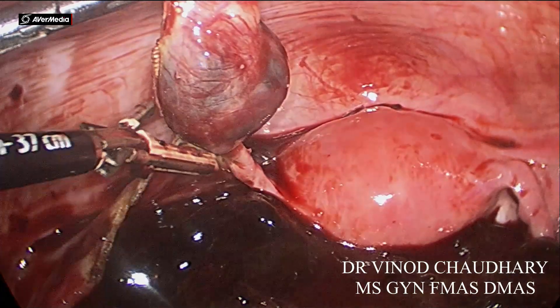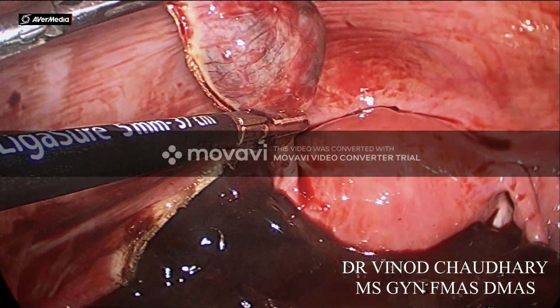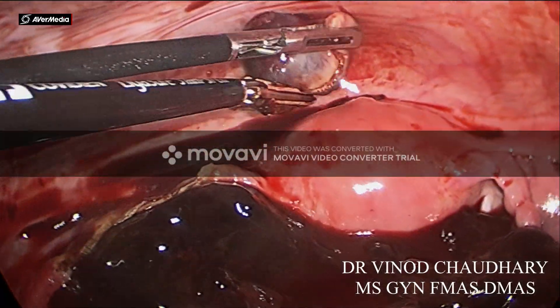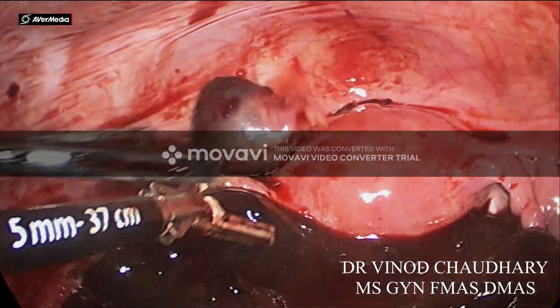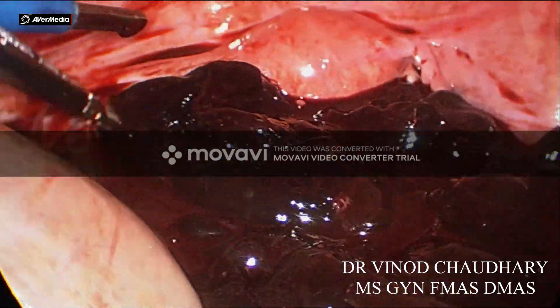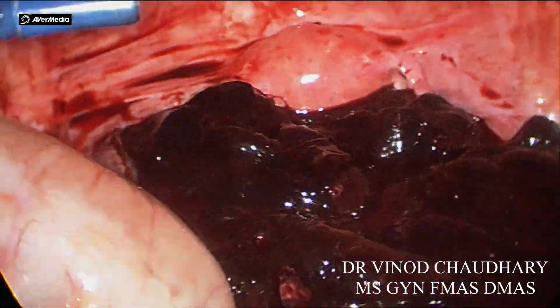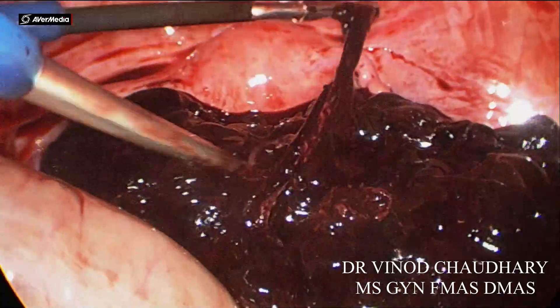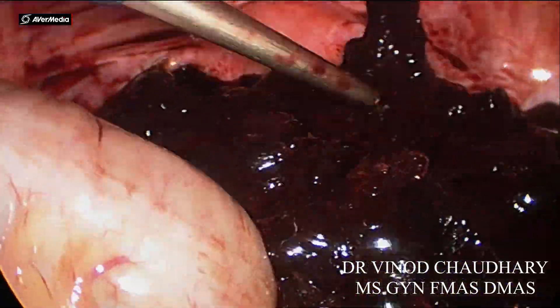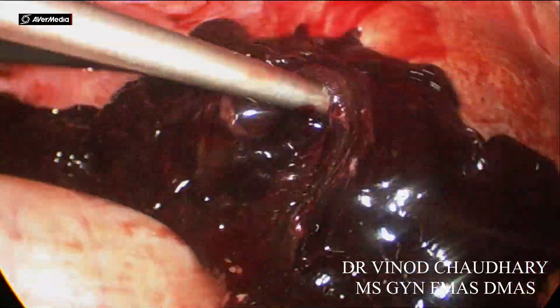The ectopic part — now just a small part is left. The surgery is almost done, but the big challenge we have to deal with is removing this clot and all the blood inside. This is only the pelvis part, but later we'll see the blood is filled everywhere.